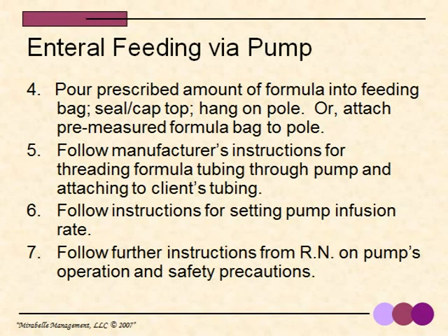Pour the prescribed amount of formula into the feeding bag. You want to seal or cap the top and then hang the bag on the pole or what you're using to attach it to. Or you can attach a pre-measured formula bag to a pole. Please follow the manufacturer's instructions for threading the formula tubing through the pump and attaching to the client's tubing. Follow the instructions for setting the pump infusion rate. And follow further instructions from your RN on the pump's operation and safety precautions.